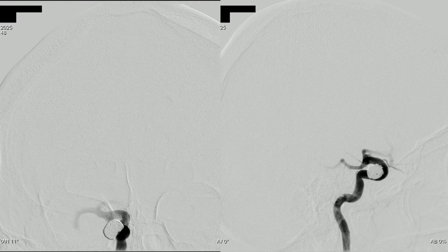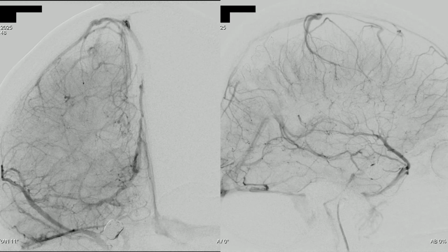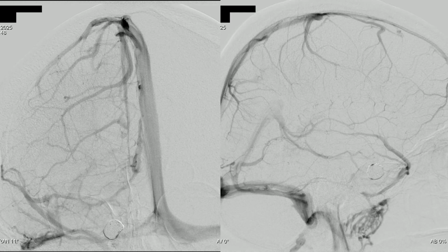And as you can see, all vessels are patent, and the aneurysm is occluded very well with a strong blood stasis in the aneurysm sac. And thus we have reached the end of our intervention.